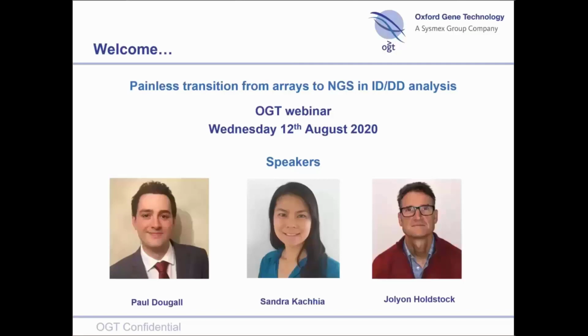Thanks, Dave. So the simple answer is yes. This is an NGS-based kit, so it's able to detect those SNVs, the single nucleotide variants, as well as insertions and deletions, and then we can assign them different types of mutations, so we can call them frameshift mutations or missense or what have you. So yes, we definitely have the capability there.